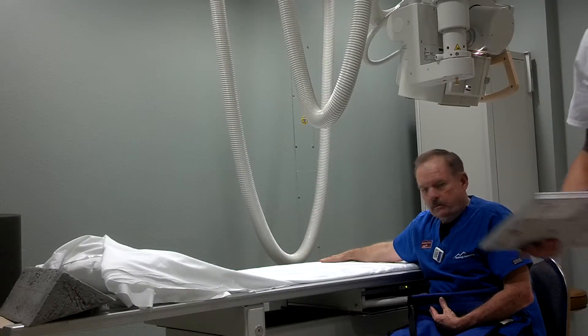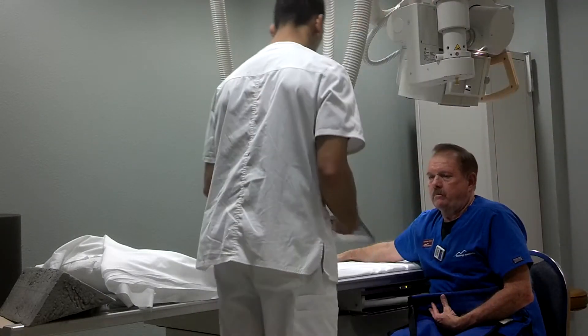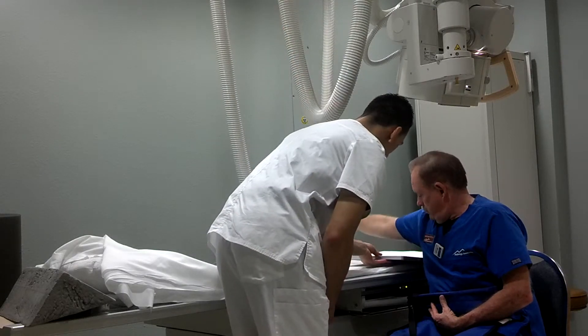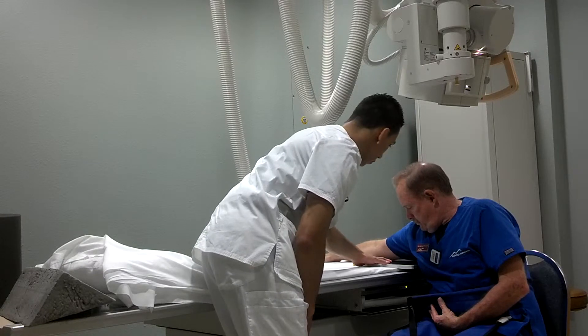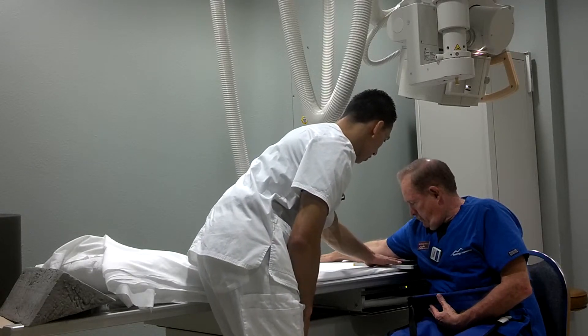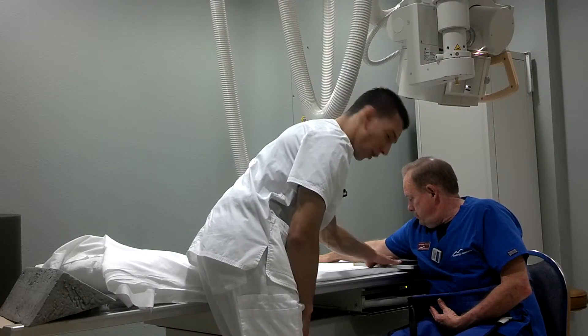So we grab our IR and I'm going to make sure that it's centered right below his shoulder joint, really tucked in there towards his body to make sure that the shoulder joint is as close to the center of the IR as possible.